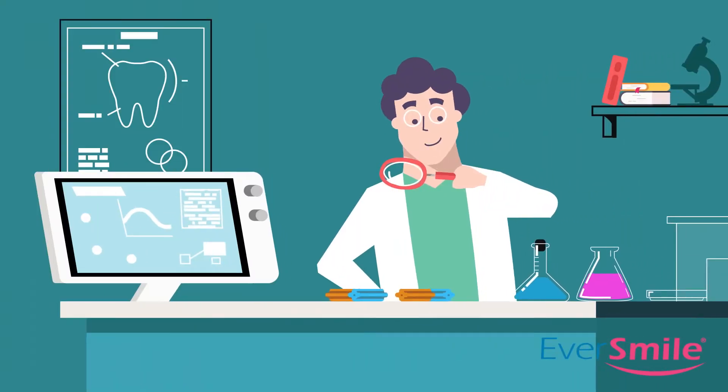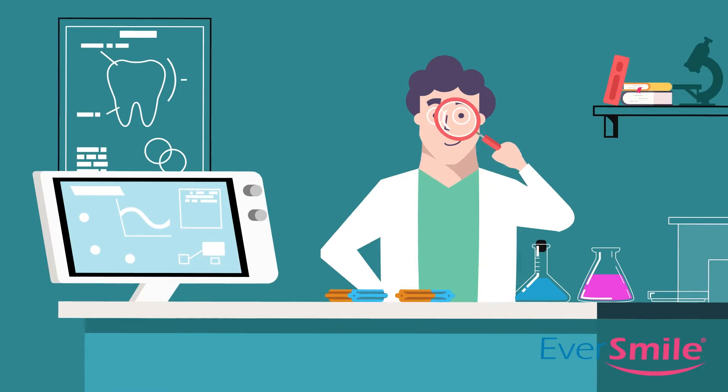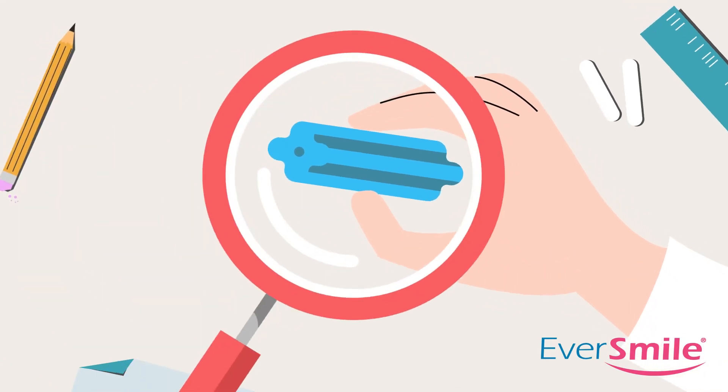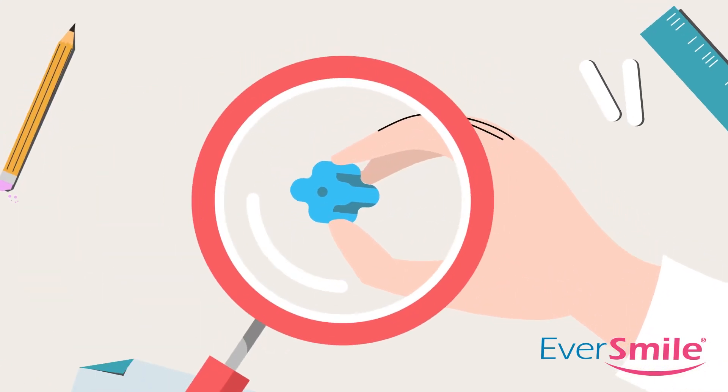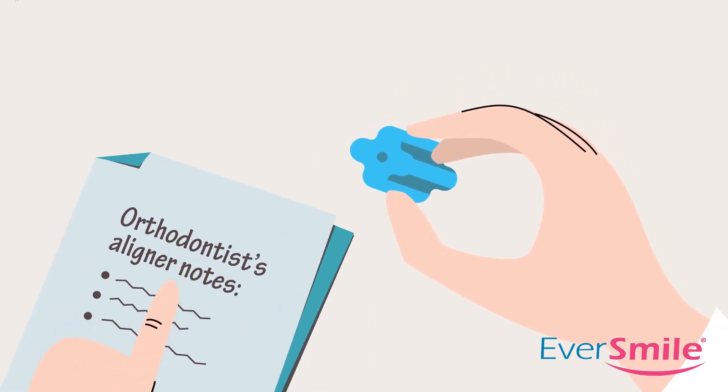OrthoChews are scientifically crafted to help seat aligners by easily fitting into the grooves of your teeth, utilizing a quadrifoil shape to ensure maximum grip. When aligners are seated properly, they fit onto your teeth the way your orthodontist intended, ensuring they straighten your teeth on schedule.